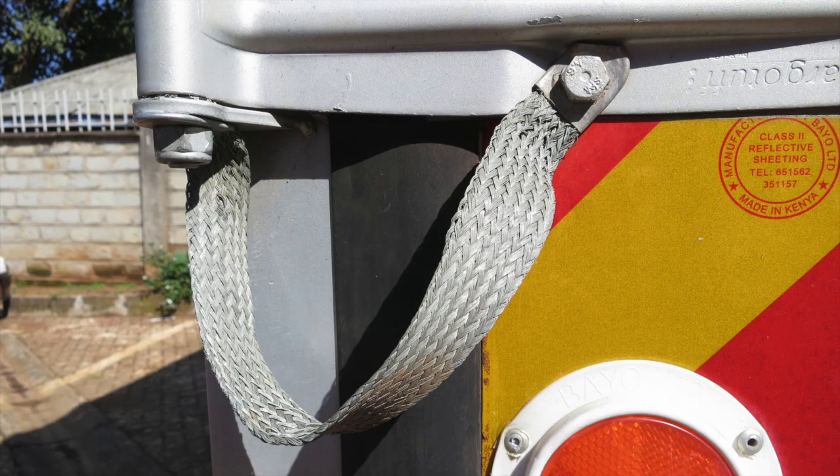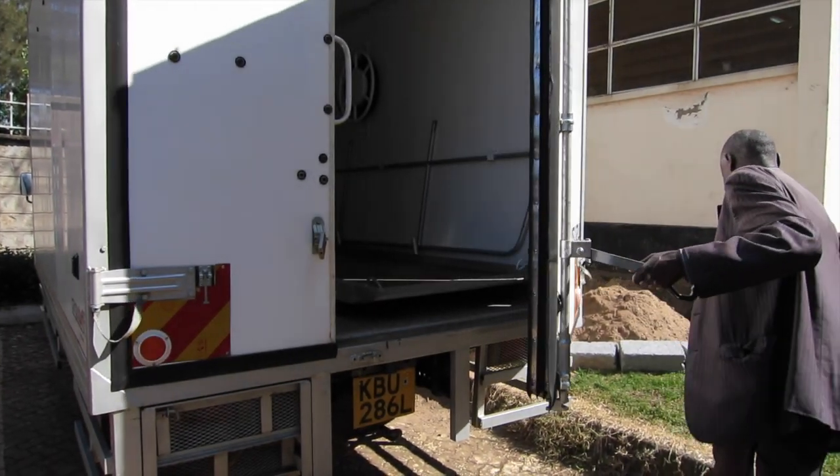Welcome to the setup video for the mobile x-ray truck. The first step is safety, making sure that both of the grounding straps are intact on either side of the truck.